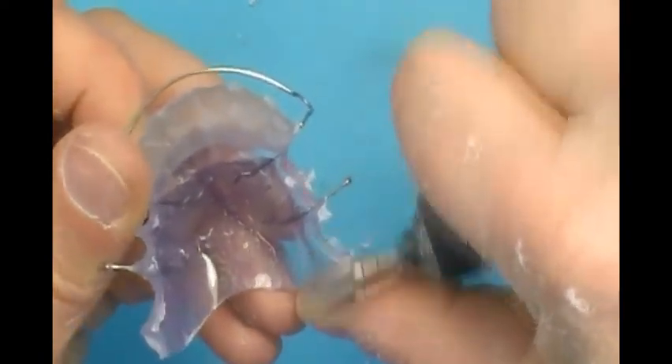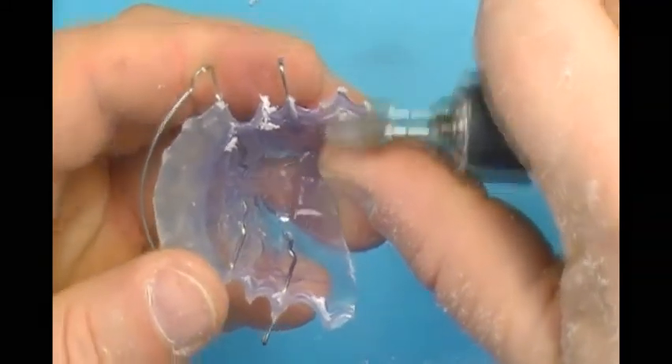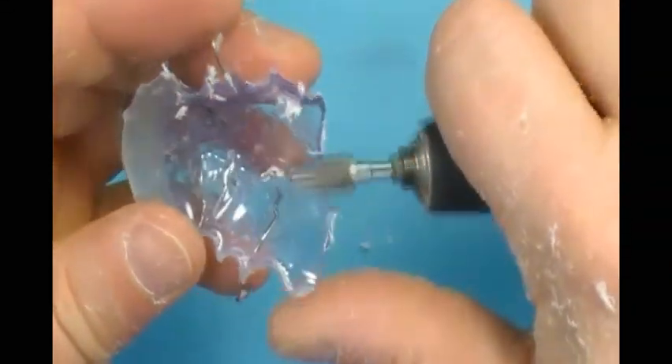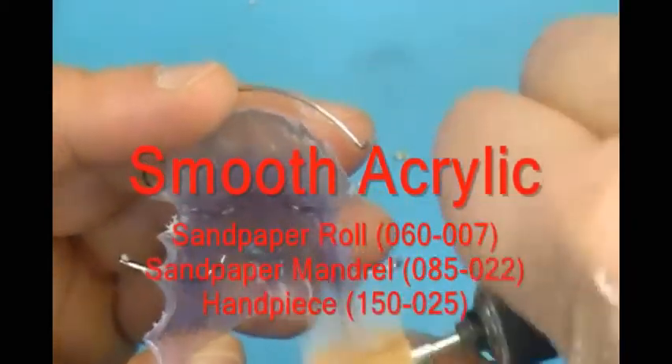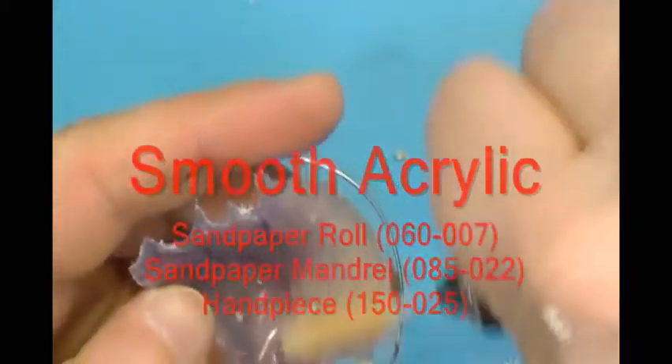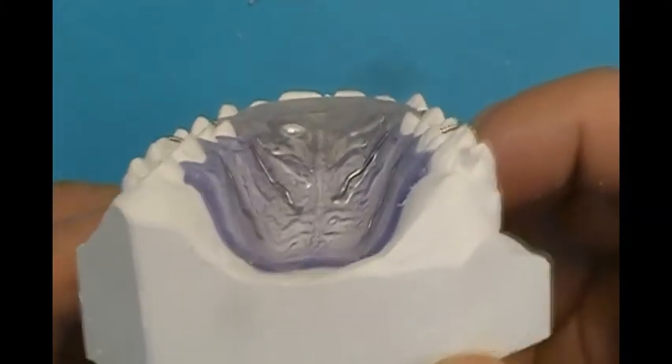Finally, the scalloped posterior and rounded anterior segments are blended into the retainer body. A sandpaper mandrel with a 3 inch strip of 150 grit sandpaper is used with a lab handpiece to smooth trim surfaces.